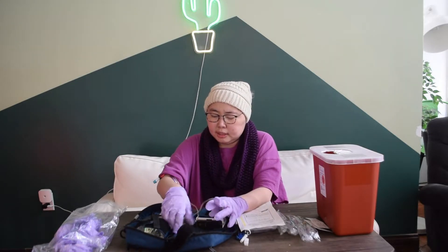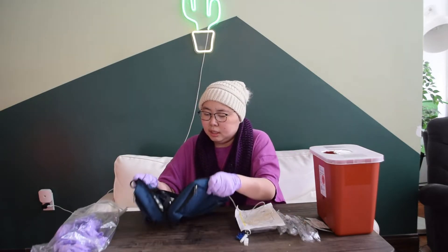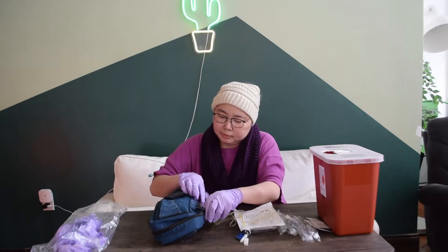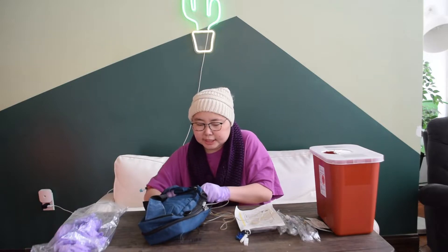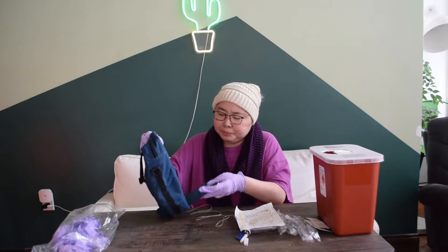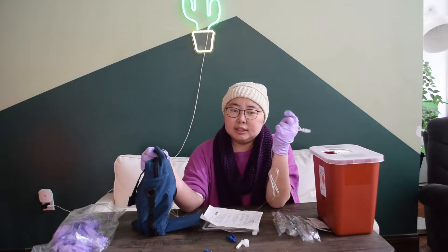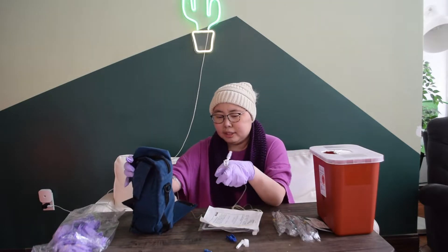It goes in just like that — not too bad. All secure. Let's zip it right up. And because it's not running yet, I don't have to make sure it's facing up now. But once it's connected to me and going, that's when you really want to be more concerned. You want to prime the tubing first to get all the air bubbles out, because some bubbles are okay, but generally you don't want to inject yourself with lots of air bubbles — that's really bad for you.